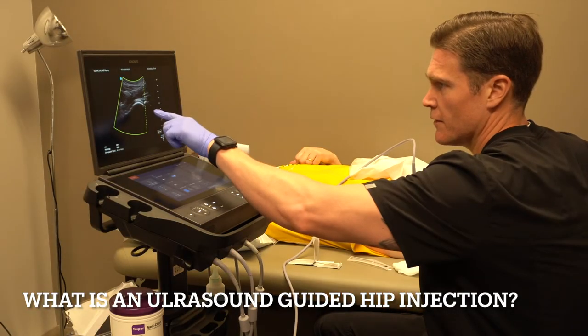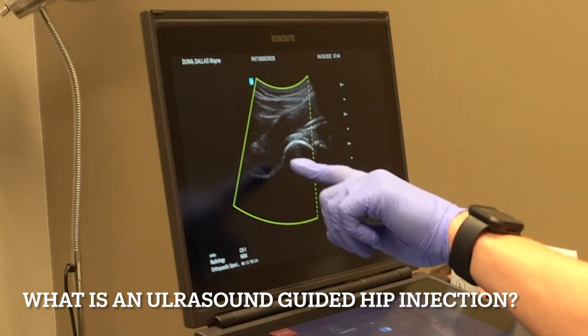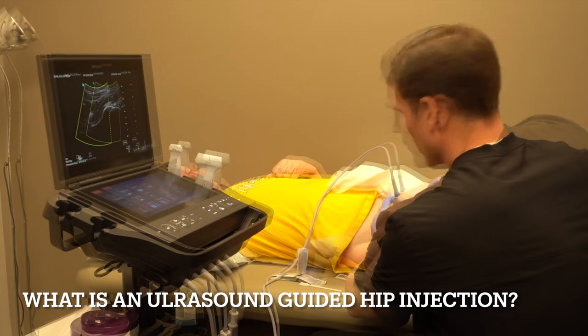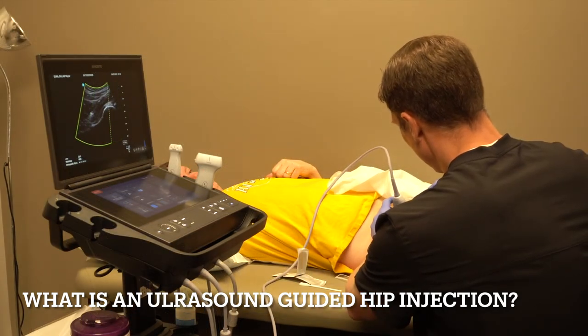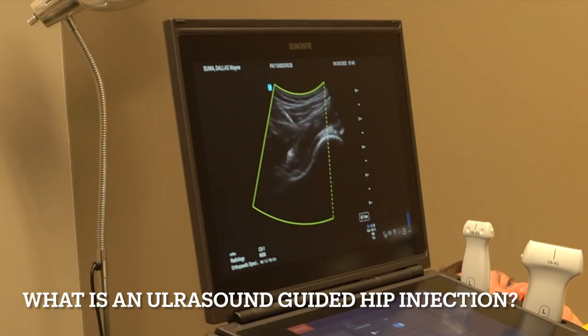Excellent anatomy. You can see the femoral head right there, muscle coming over, and right there at the neck junction is where we're going to try to go. One, two, three — big poke. You can see the needle coming right there on the screen. Perfect, right on bone.